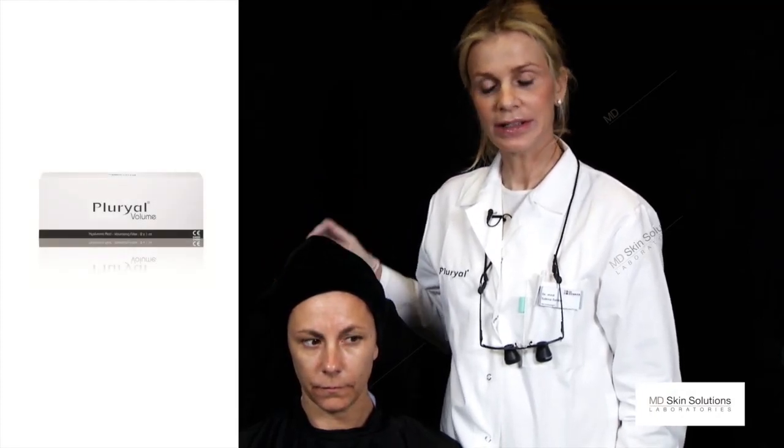My name is Dr. Sabine Zenker. I'm a dermatologist from Munich, Germany, and I will showcase you today the use of the Pluryal range in this patient. First of all, Pluryal volume to enhance the projection of the cheek area. Then we will redefine the perioral area with Pluryal.